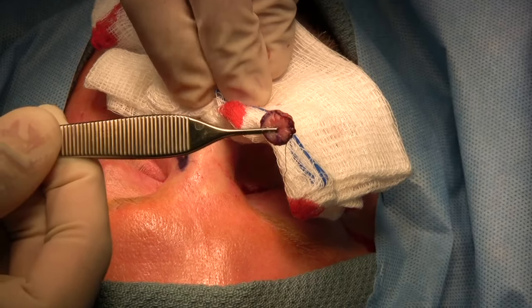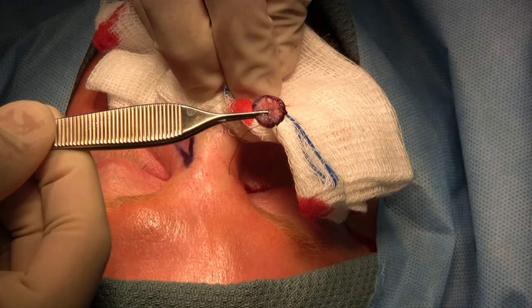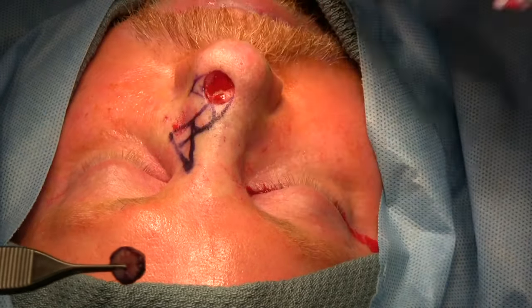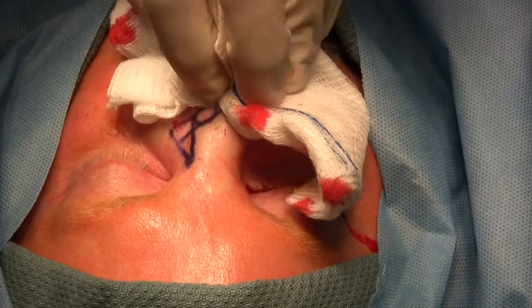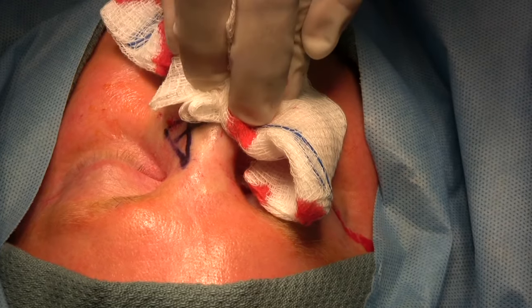As you can see, the specimen has been removed, and it has been oriented with a long suture at 12 o'clock and a short suture at 9 o'clock, and we can see our defect at this time. We will send the specimen for frozen section, and in the meantime, we perform hemostasis and then wait for the margins to come back.